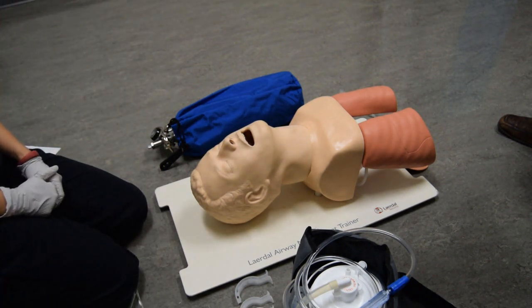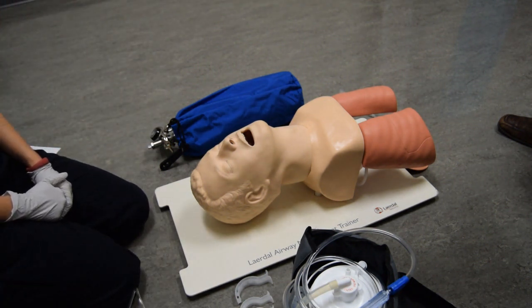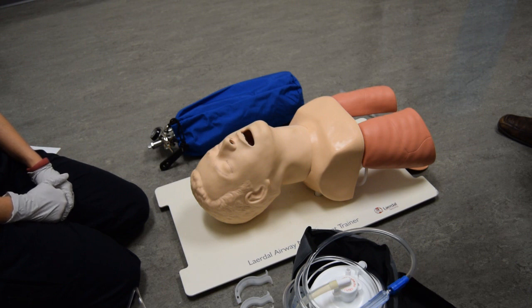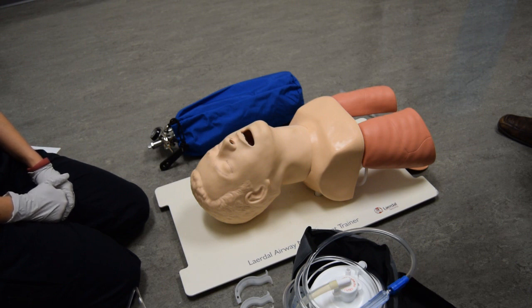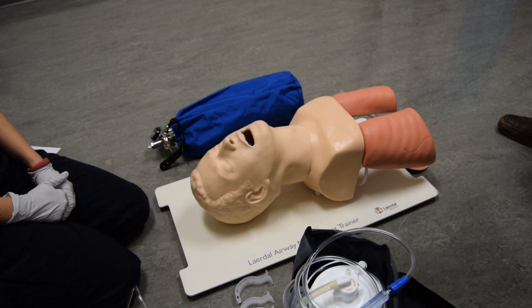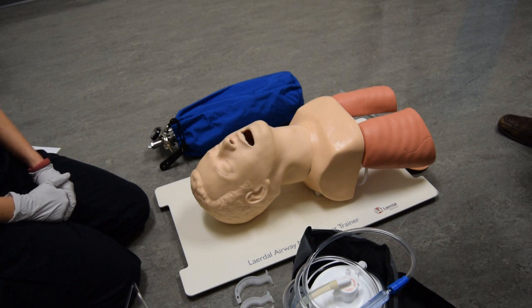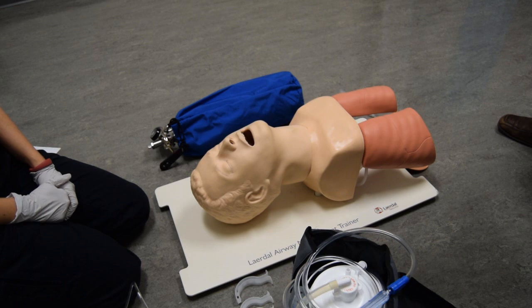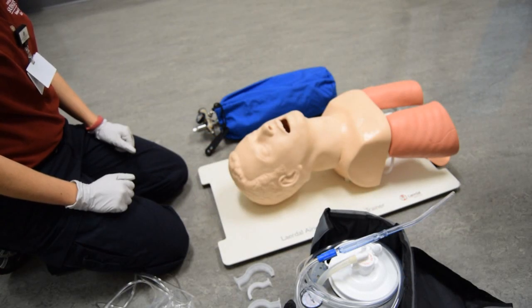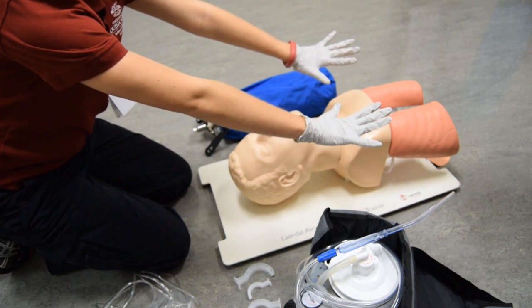Upon your arrival to the scene, you find a patient lying motionless on the floor. Bystanders tell you that the patient suddenly became unresponsive. The scene is safe and no hemorrhage or other immediate problem is found. You have five minutes to complete this skill. Takes or verbalizes appropriate body substance isolation precautions.